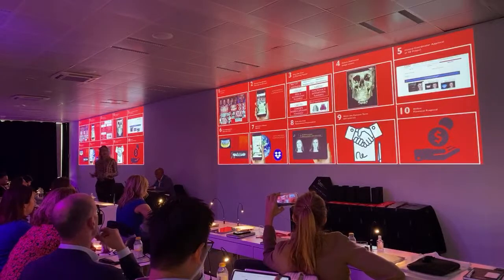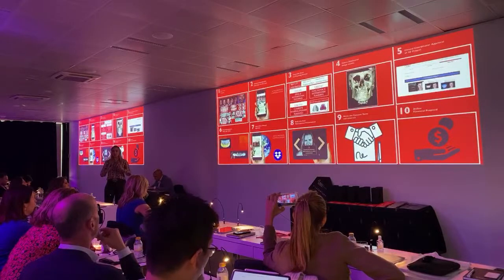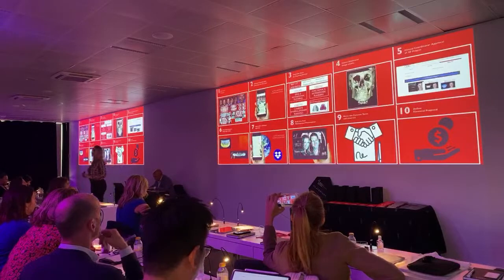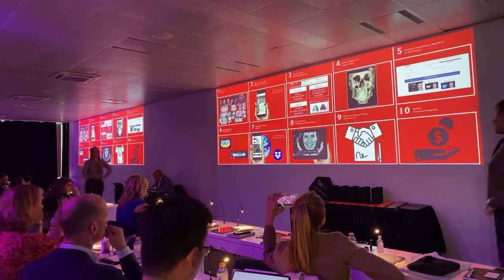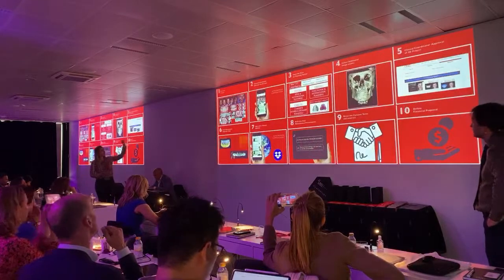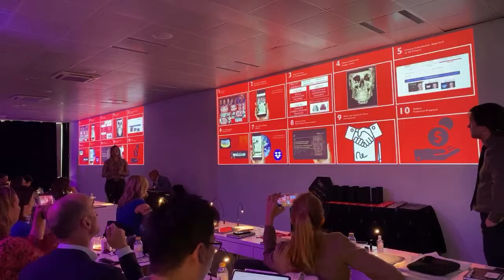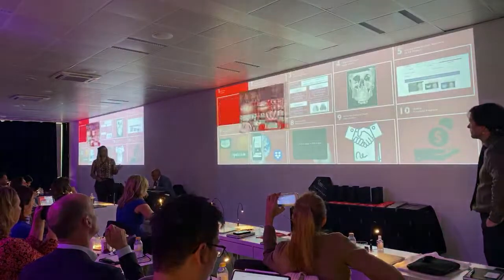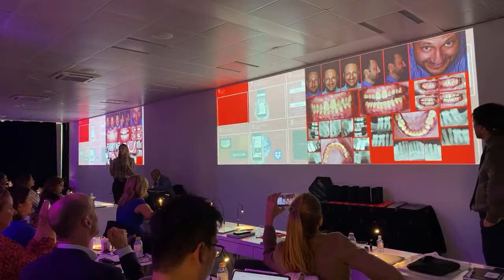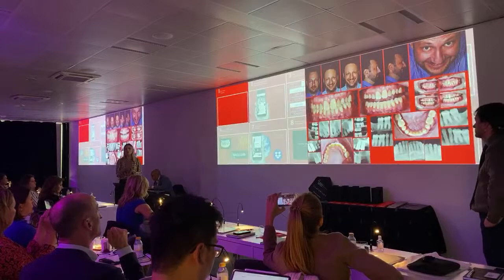So with Robert, and really I had his help on doing this because he really likes to have a process for everything, he sat with me and said, Jackie, you need to design a process. And I said, okay, let's do it. It's not my area, but this is what I do when the patient arrives. The first thing that the DSD coordinator will do for me is to build an initial template. What is the purpose of it? I need to have a clear view of the patient, very fast, to tell the DSD coordinator what I want her to do with everything.